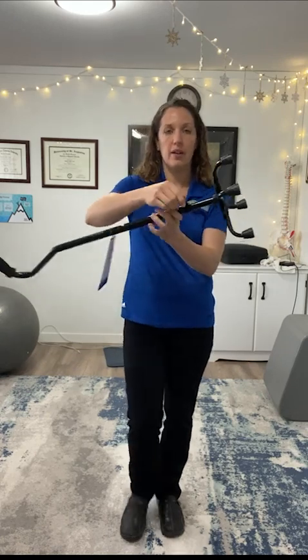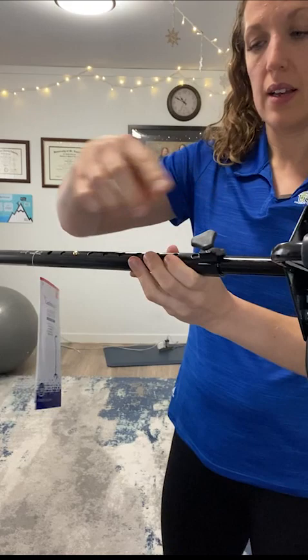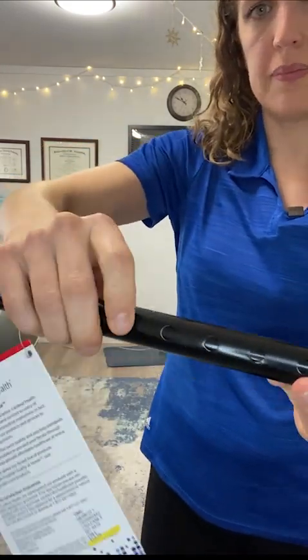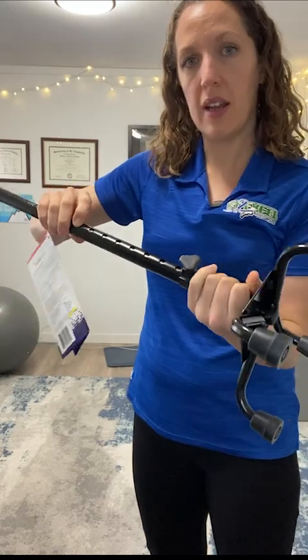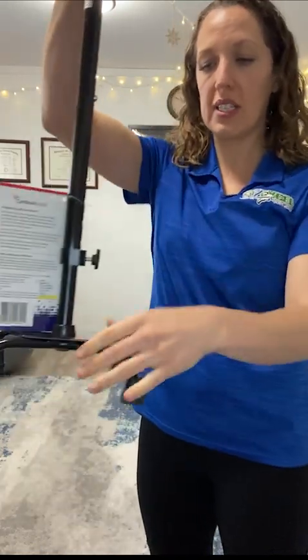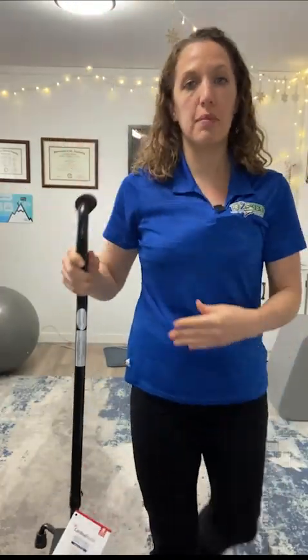So I would adjust this by pushing in this little button — you can see that's a button on the opposite side. Now I've just twisted the base, and now this is set up to be on this side. So if this leg is injured — this is my left leg — I would put the cane on the right side.